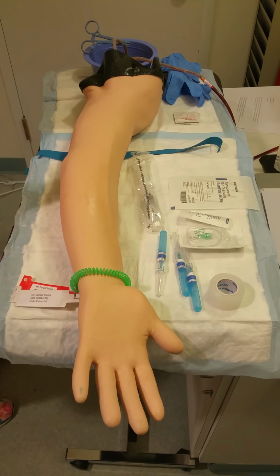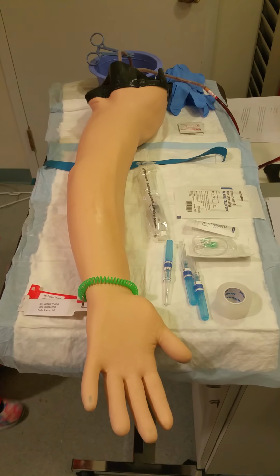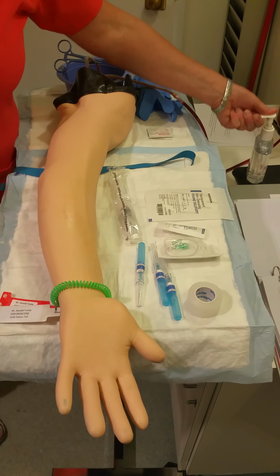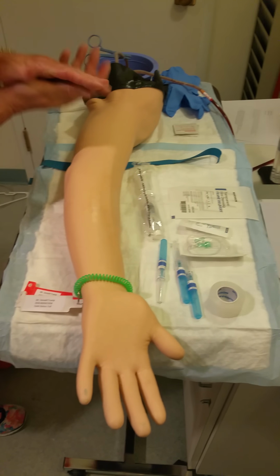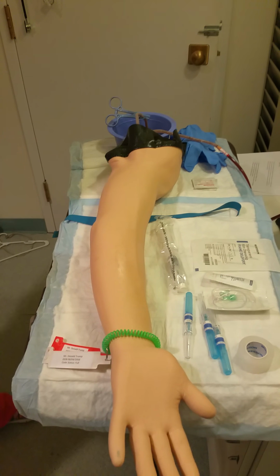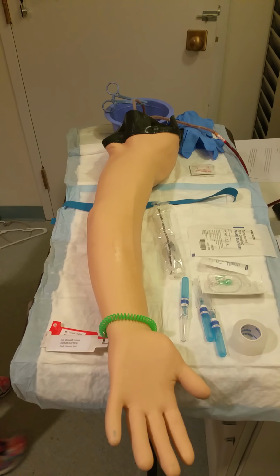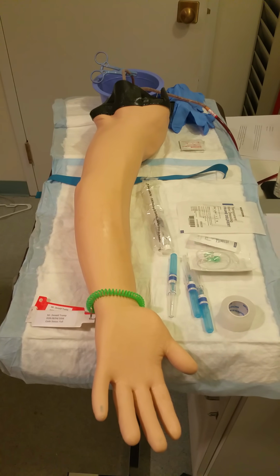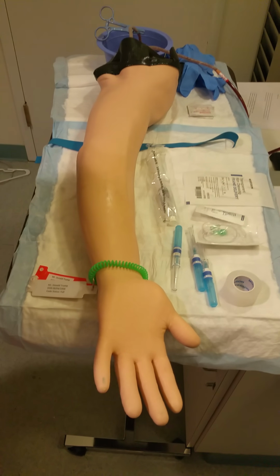Hello, Mr. Trump. My name is Nina. I'm your student nurse from the Denver School of Nursing Hospital. I'm here to initiate a peripheral IV for you, and I'm going to perform hand hygiene with plenty of alcohol gel for your safety. Mr. Trump, would you please tell me your name and date of birth?